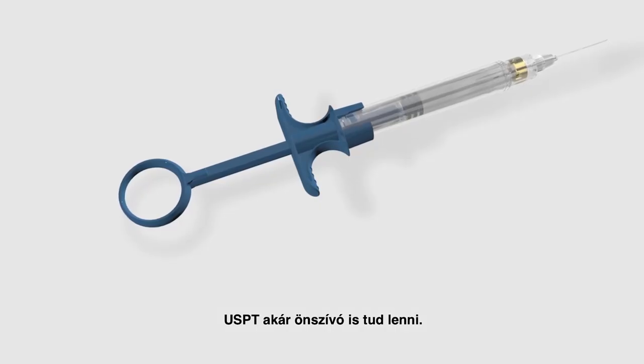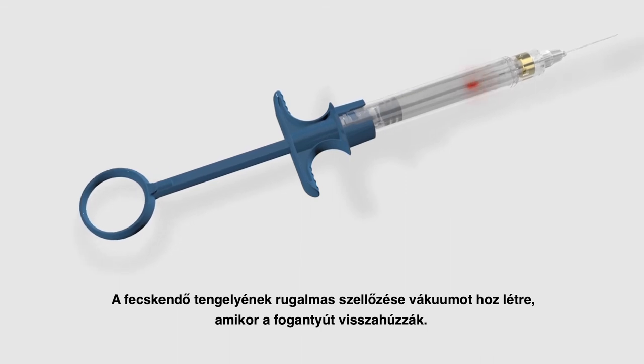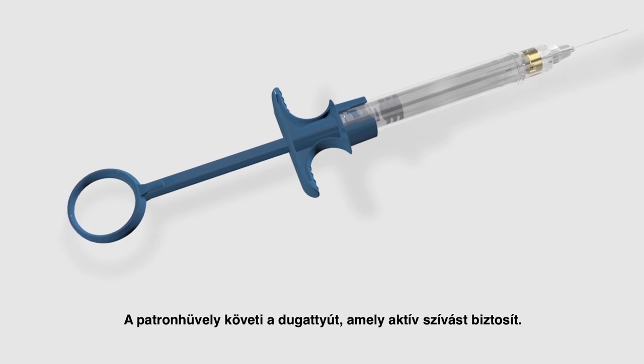You can also self-aspirate with the Ultra Safety Plus Twist. The pliable o-ring on the shaft of the syringe creates a vacuum when the handle is pulled back. The cartridge bung follows the piston, providing active aspiration.